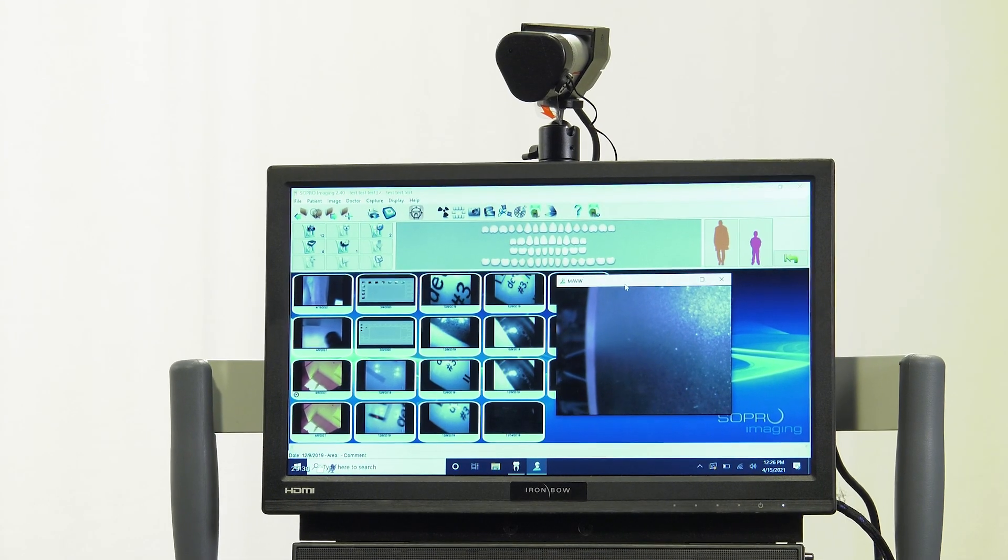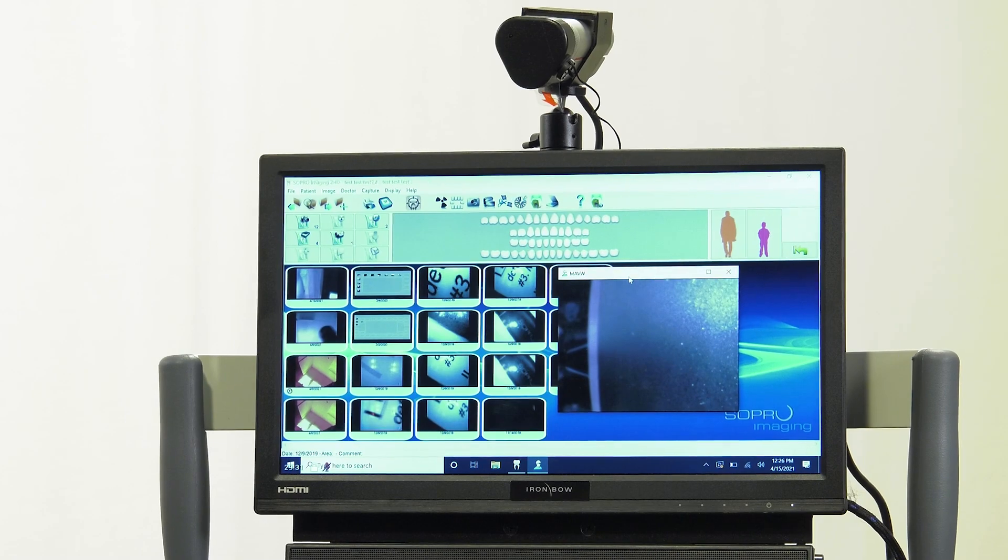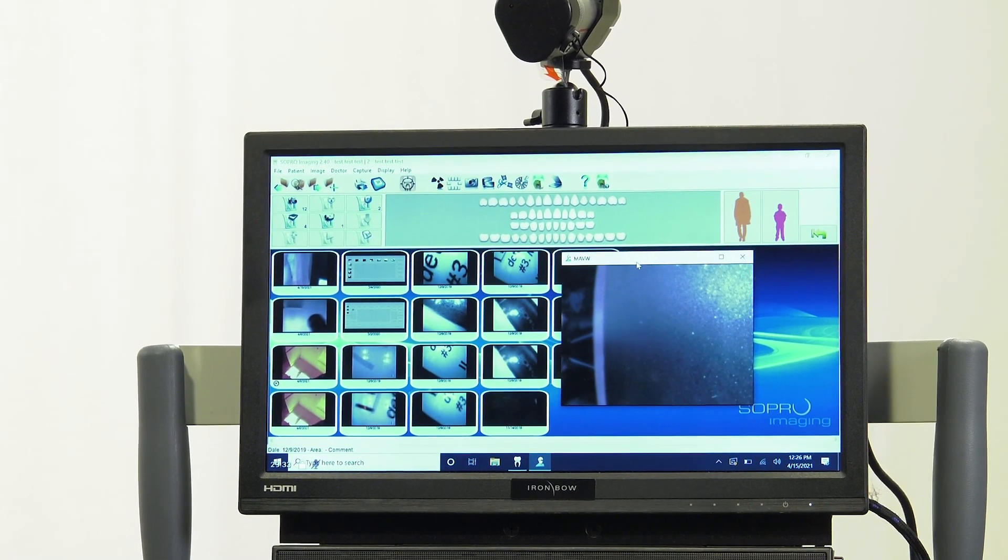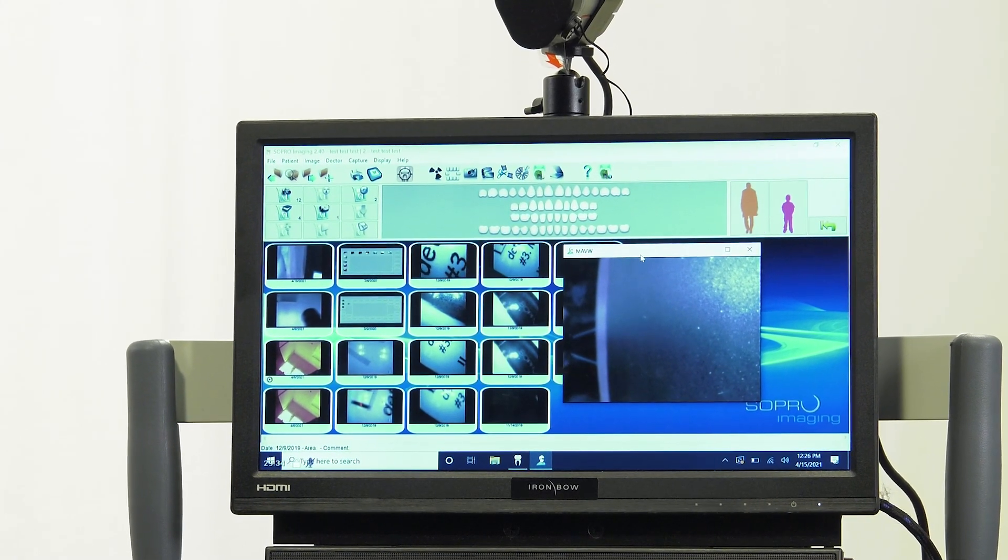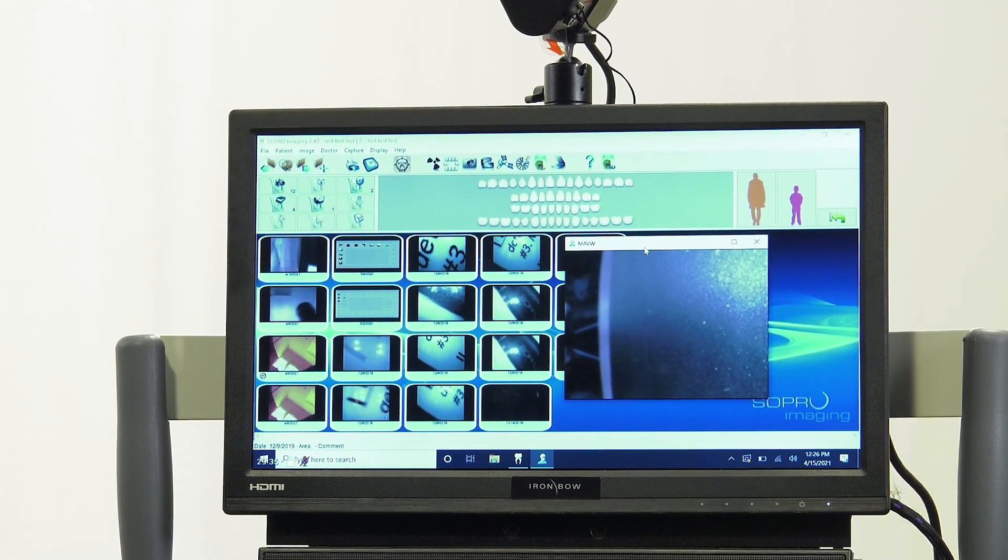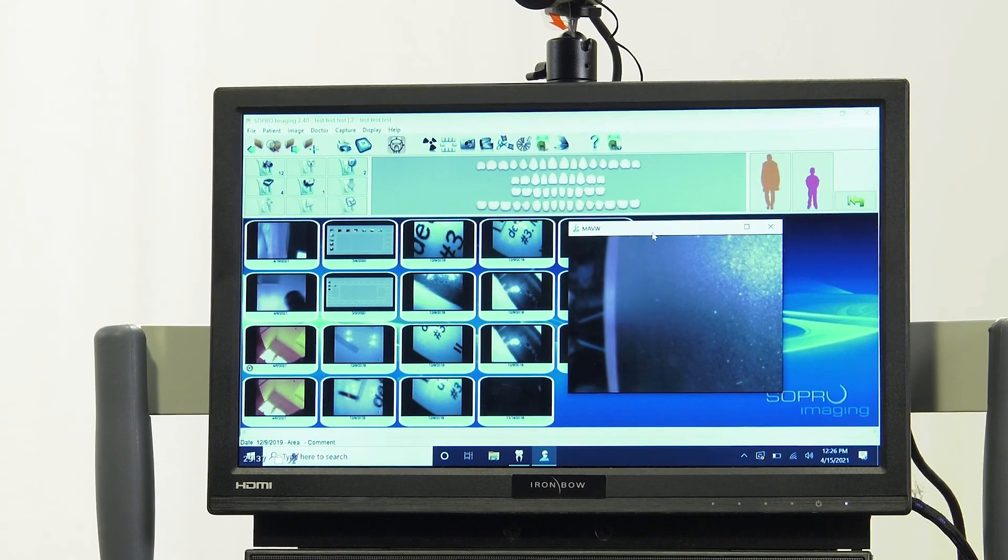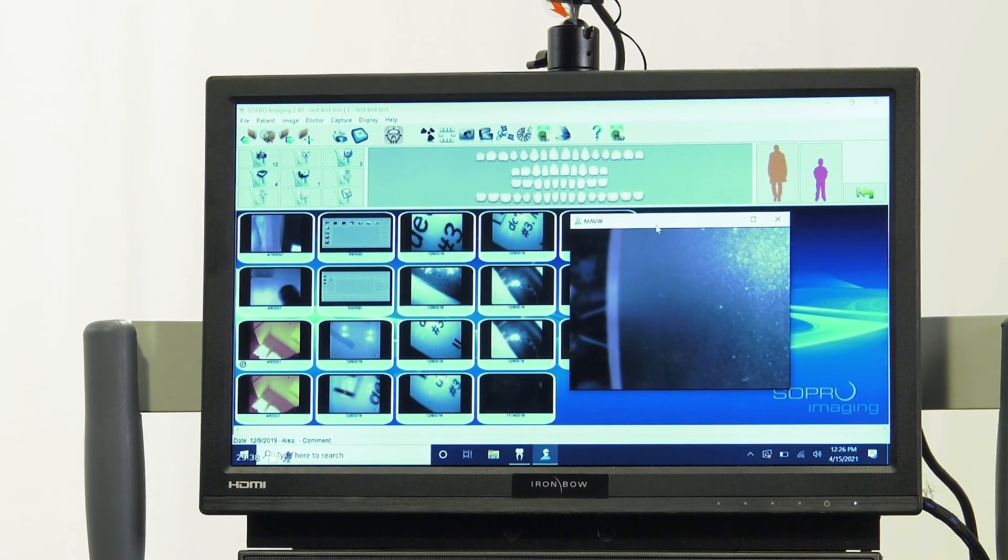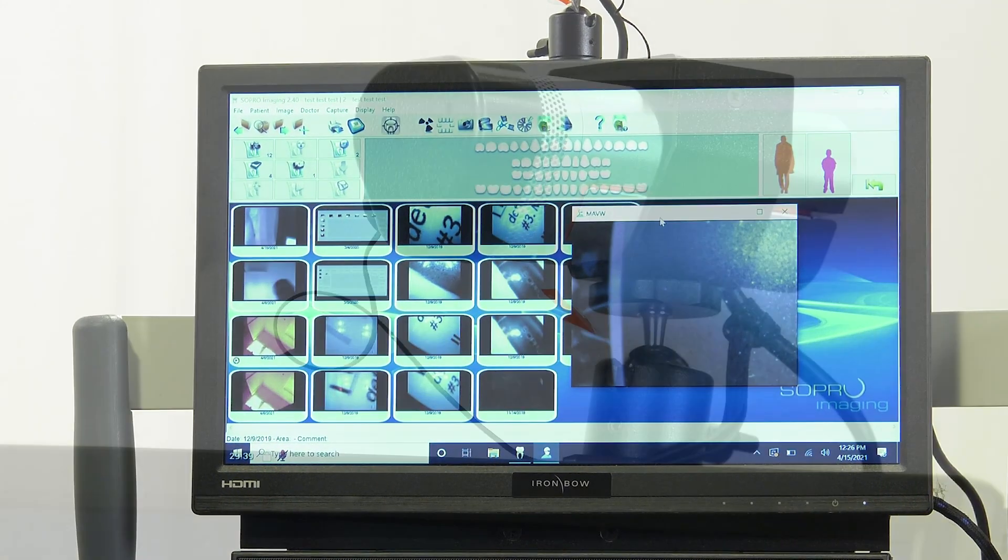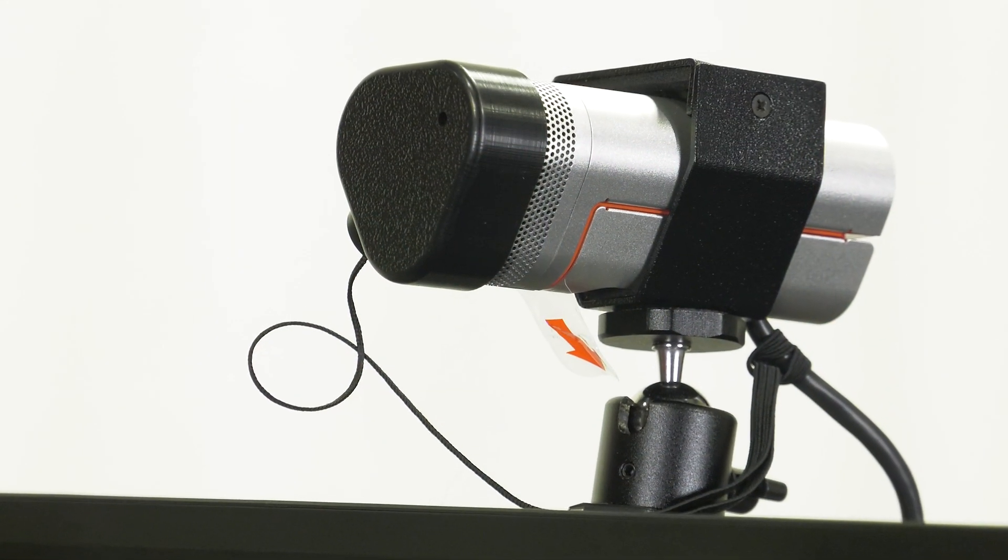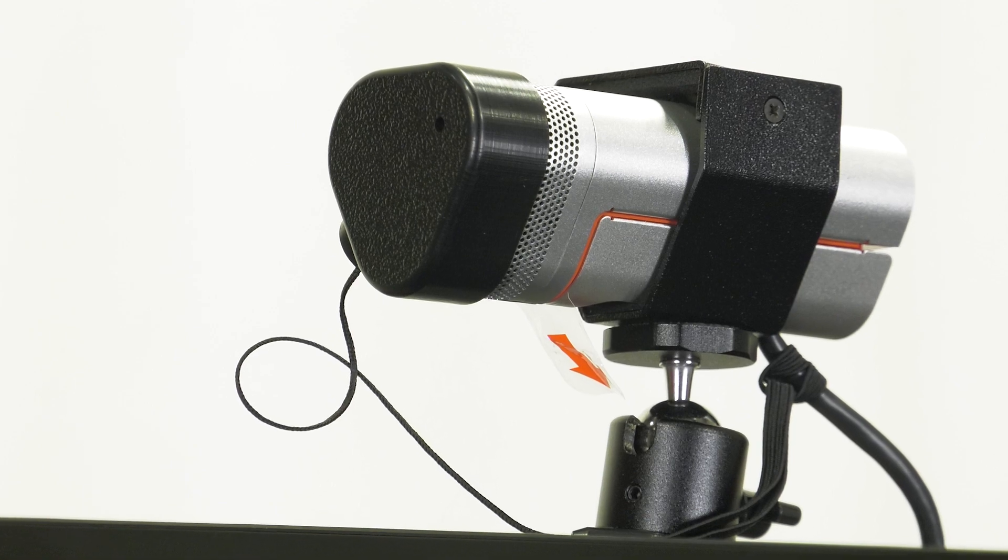Note, the intraoral camera can integrate with other imaging systems as well. If you are interested in utilizing it with a specific imaging system, you must inquire with the imaging systems developers for further information.